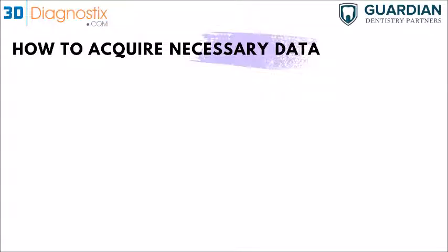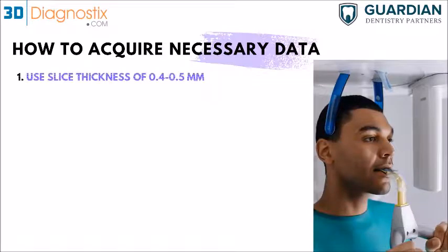There are some recommendations that we provide you with before you scan the patient, just to prevent having any challenges with using those records. The first thing is a cone beam CT scan, not a conventional CT scan, although it does work, but a cone beam CT scanner gives you more resolution, and we recommend a slice thickness of 0.4 to 0.5 millimeters.